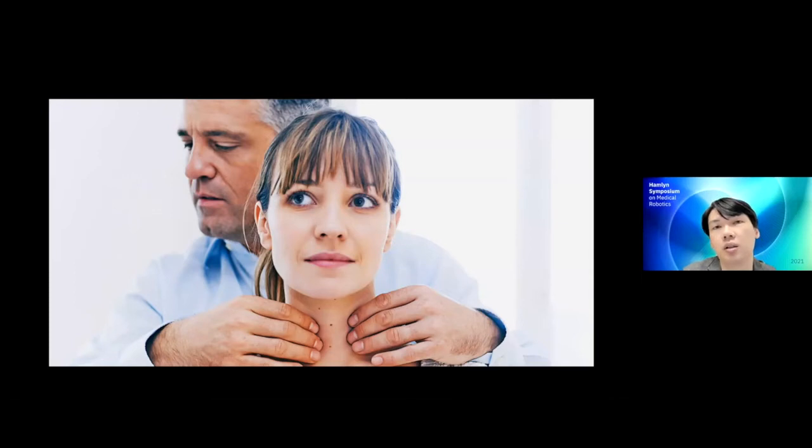If you feel something's a little different, whether it's maybe stiffer, harder, a lump, you can try to see whether there's a problem, right? And that's how physicians have used touch. In fact, this is a routine screening procedure by clinicians, palpation, to determine if you have any possible need for further interventions or diagnosis needed, right? So the skin is clearly very important, and there's a lot of exciting technologies from Prof. Ravinder's lab and many others, right, looking at solving the challenge of bringing touch to machines.